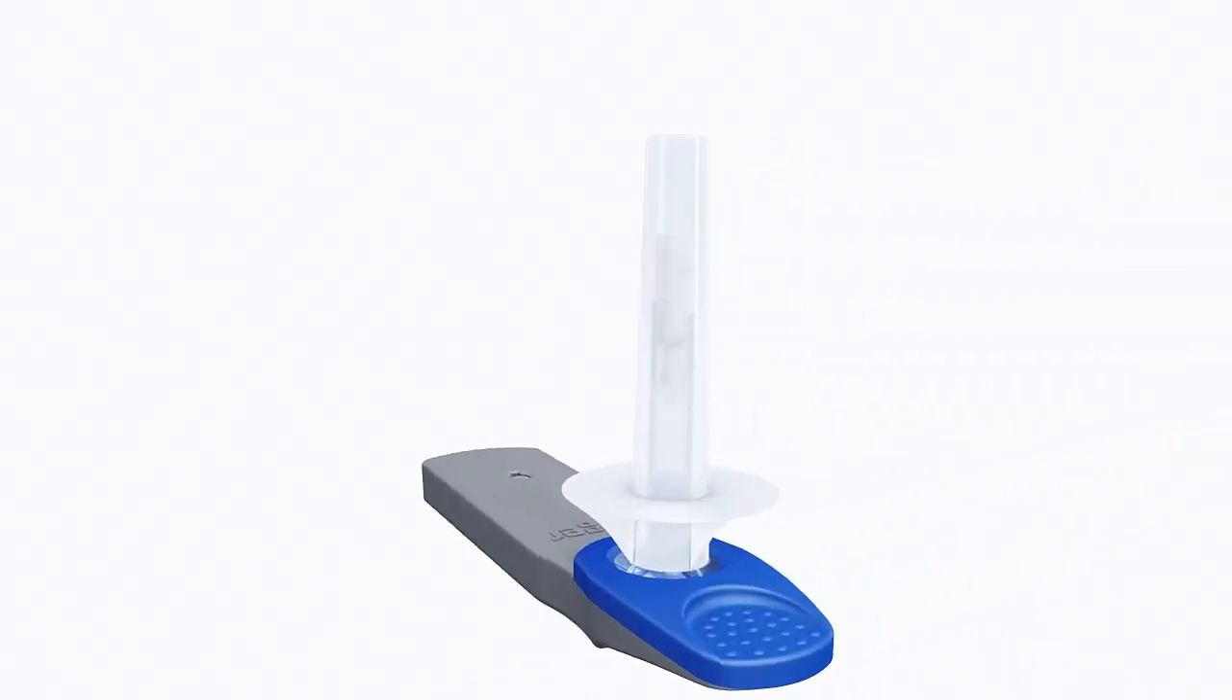To collect a sample, take the test cassette out of the foil pouch and remove the cap. Now hand the test cassette to the test person. The test person should move the collector back and forth from one cheek to the other several times.